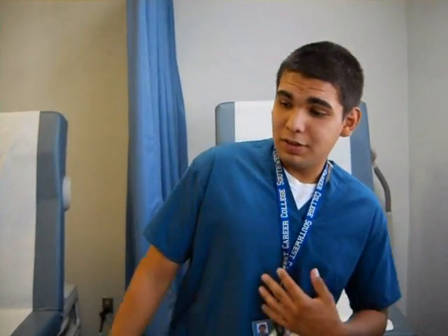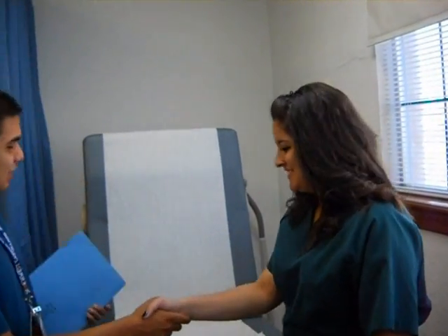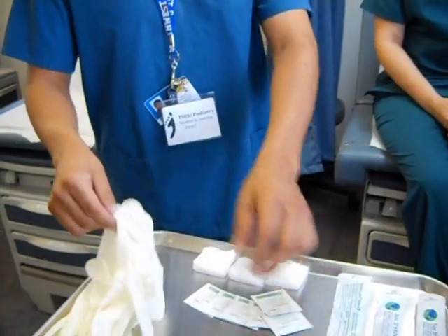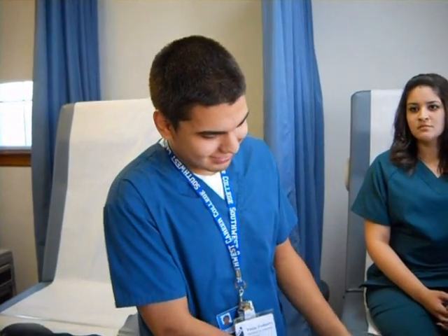You always want to identify the patient before they sit in your seat, and always make sure you have a sharps container and hand sanitizer near you at all times. When working in a medical facility, always identify your patient: 'Hello, are you Bianca Avalos? Yes. Good morning, please have a seat right here.' It's important to identify your patients to make sure you don't treat the wrong patient.